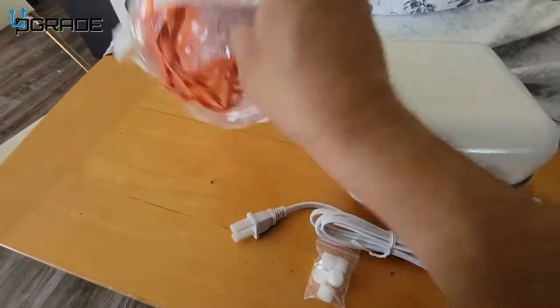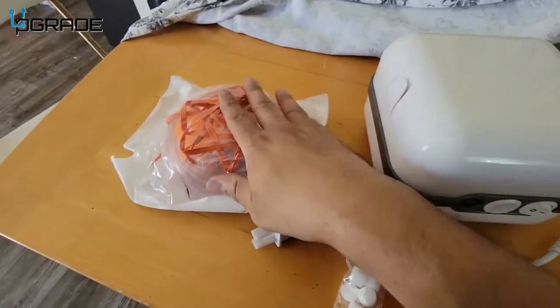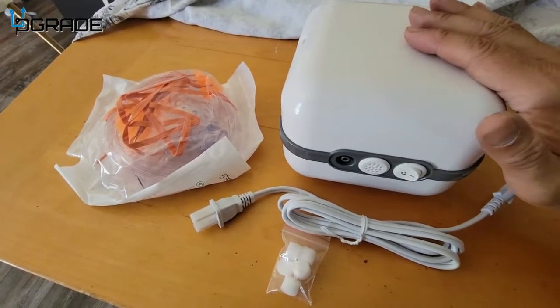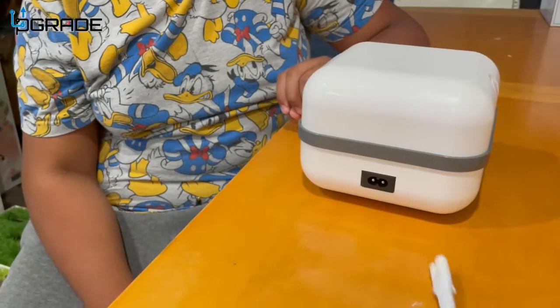They also give you different types of masks to wear so you can breathe the medicine in, with straps to secure them. We actually have somebody who suffers from asthma and they're going to demo the system for us, so let's take a look at it.